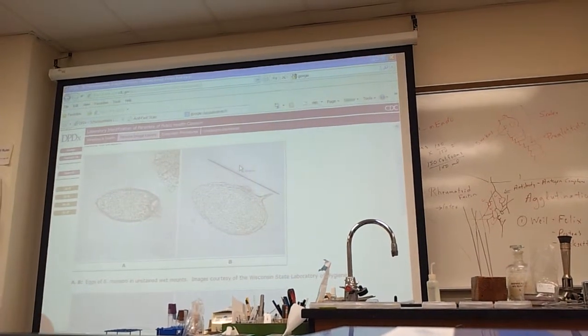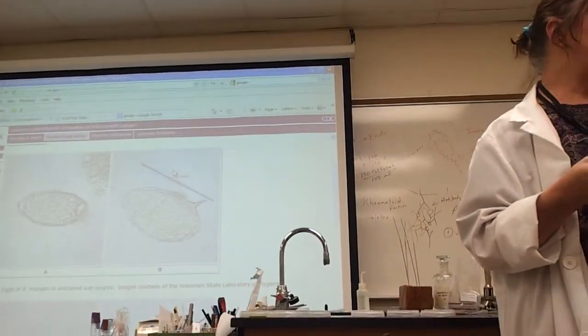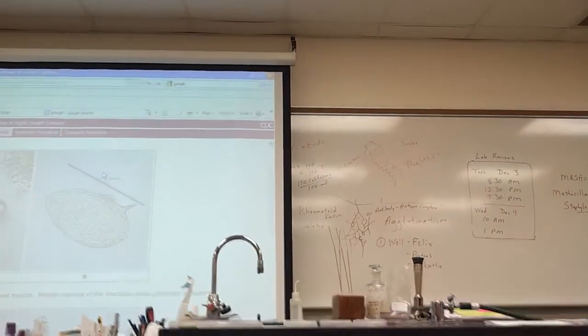The hookworm, you have to have something to tell you it's got hooks, it's coming in. It's not so much indicative by its egg. Trichuris is indicative. That's your whipworm. And I'm going to show you these pictures in just a minute. It looks like a fruit, a lemon.